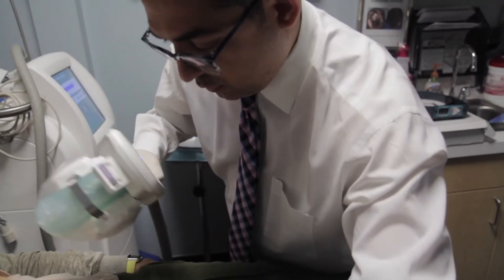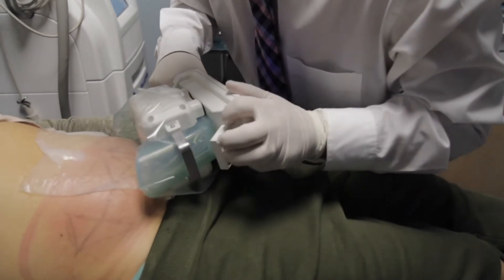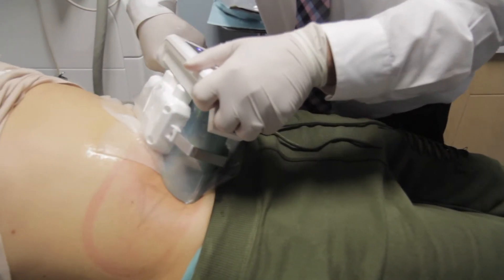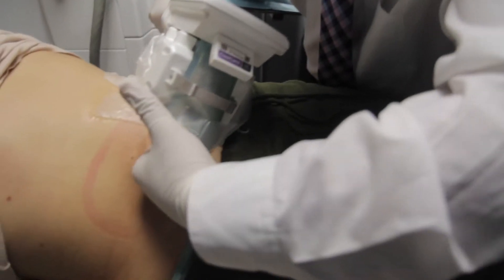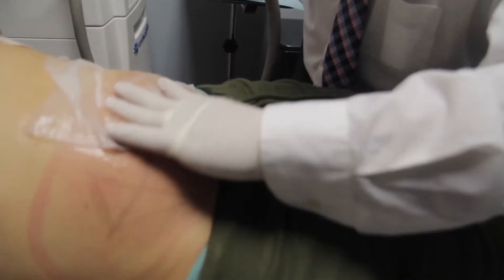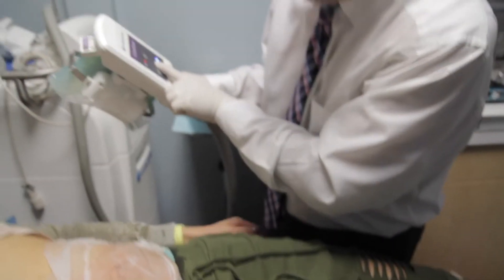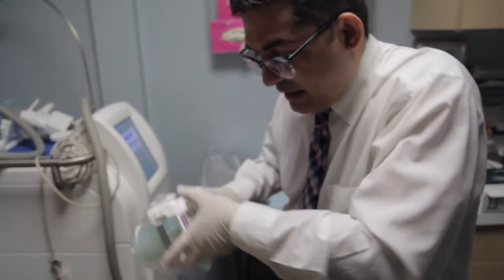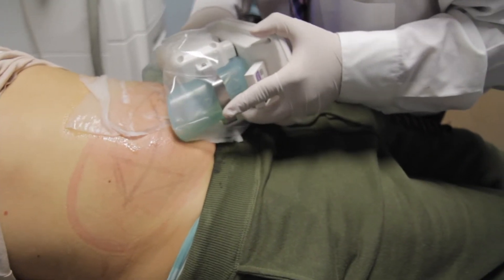Now I'm going to put this on. And as you can tell, it basically sucks in the area. Sometimes I stop the machine for a second to release the vacuum and take a look — I do this quite a bit because I want to make sure we are treating the correct spot. It was actually the correct spot, so I'm happy with that.